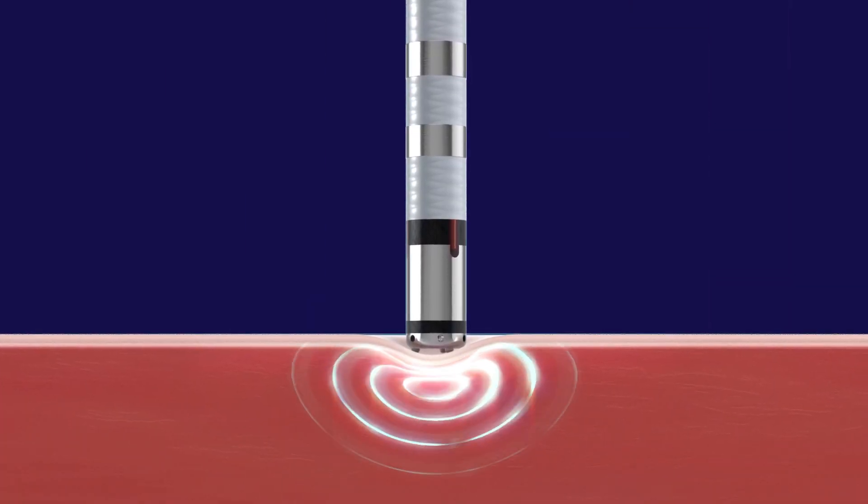If you're just delivering power, you can deliver just the right amount, but you can just as easily deliver too little or too much. The question is how do we get it just right, and that's where we have to bring temperature back into the equation.